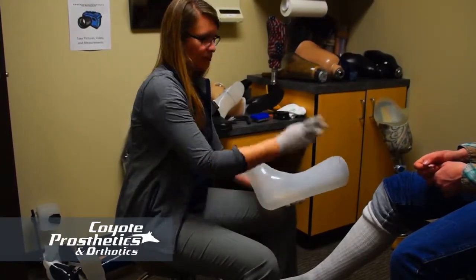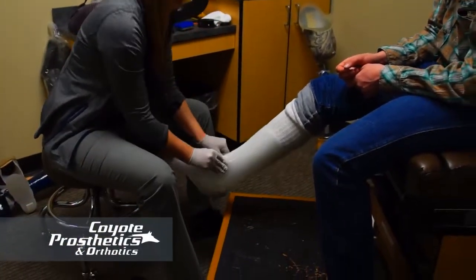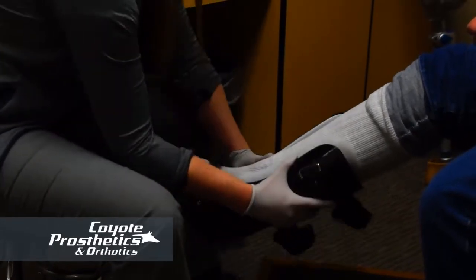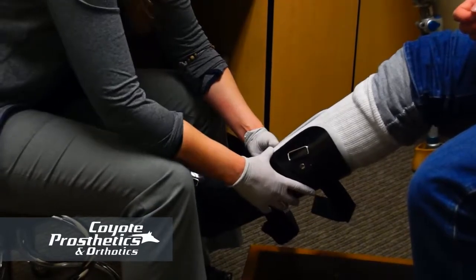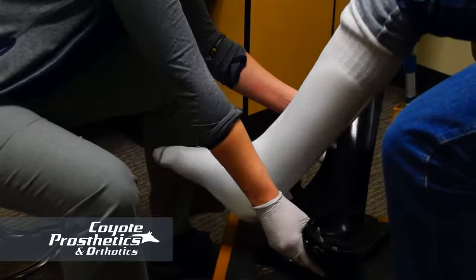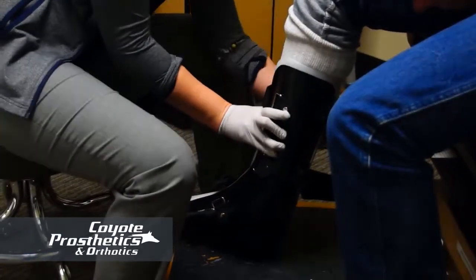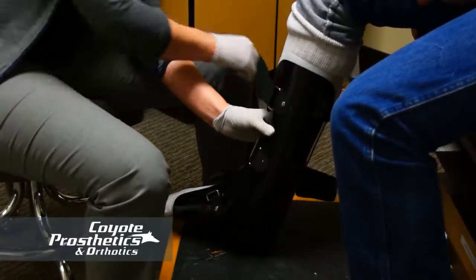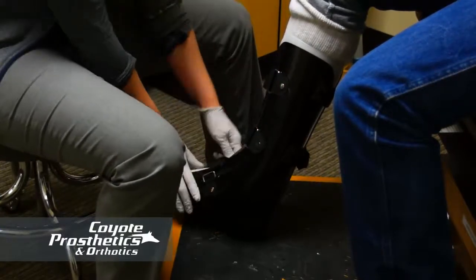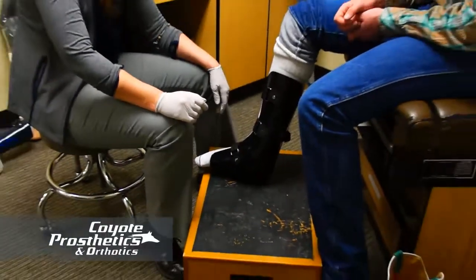Everything else is the same as before — make sure you have the sock on and follow the gradual break-in period. To put this one on, open it in the front and drop your foot in. Since it opens from the bottom, there are two ways to do it: you can close it around the foot directly, or if you have trouble bending down — such as after a back fusion — lay the brace on the ground, step your foot into it, and it will close itself. Tighten the straps snug but not so tight that you feel like you're losing circulation, then put your shoe on.